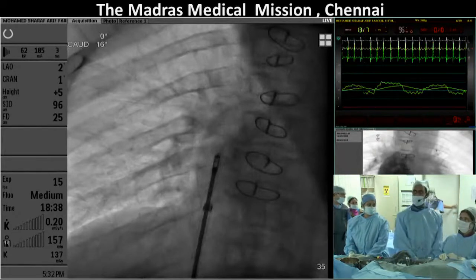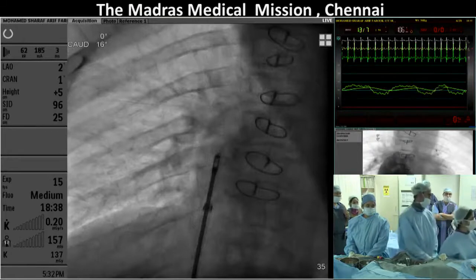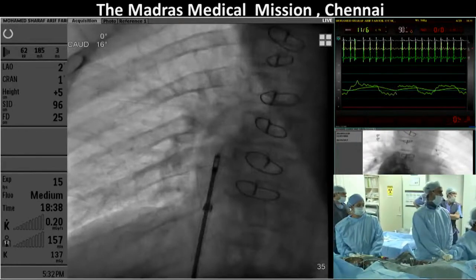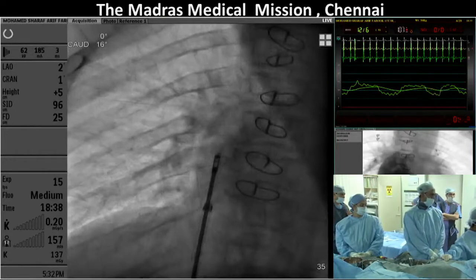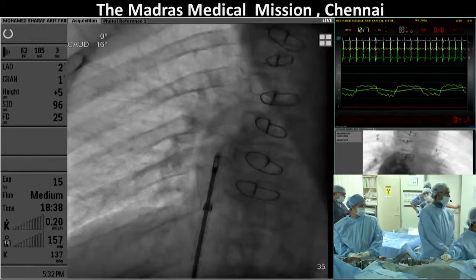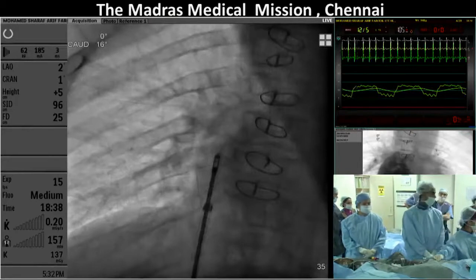When he's awake. But obviously, the most important number here is his aortic saturation. If his aortic saturation is above 88 or 89, that's about as good as you can hope for. Yeah, we are looking at the aortic saturation now. You won't know what that is for weeks or even months. We are also looking at the aortic saturation. It was showing 90, 91, and we are waiting for a good trace.